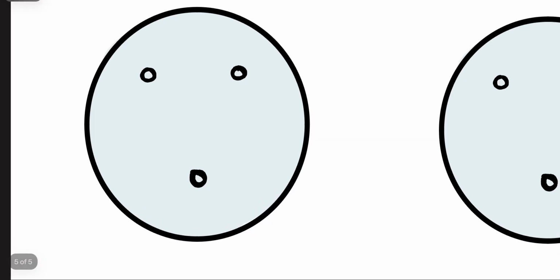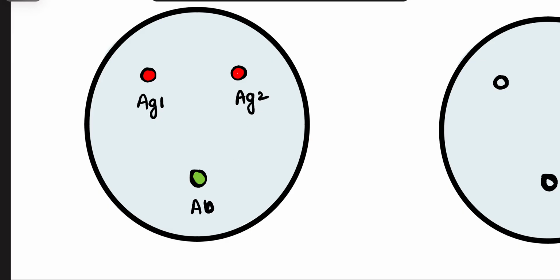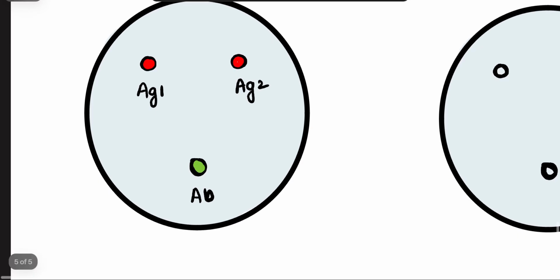The first one here is the Ouchterlony method. Here what we are doing is, in the green we are pouring the particular antibody, and here we are pouring the particular antigen. Now suppose the two antigens are similar, we have to detect whether the antigen which we were confirming is even that antigen or not. So this is the well of antigen 1, this is the well of antigen 2, and this is the well of antibody. Now let us assume the two antigens are very similar to each other.